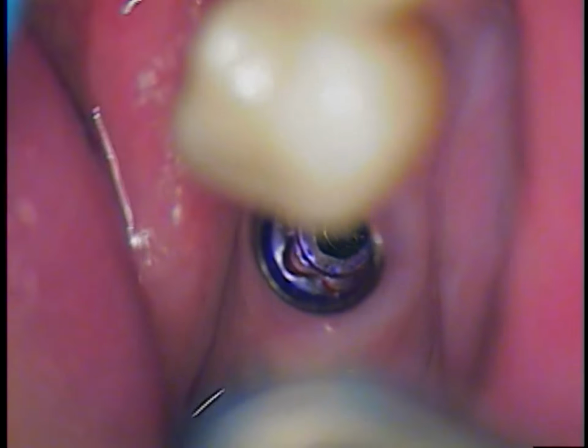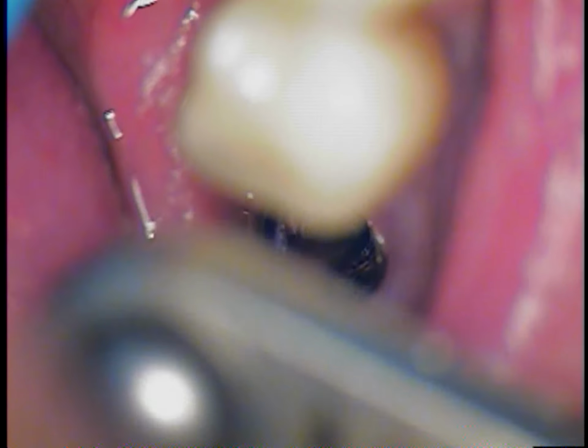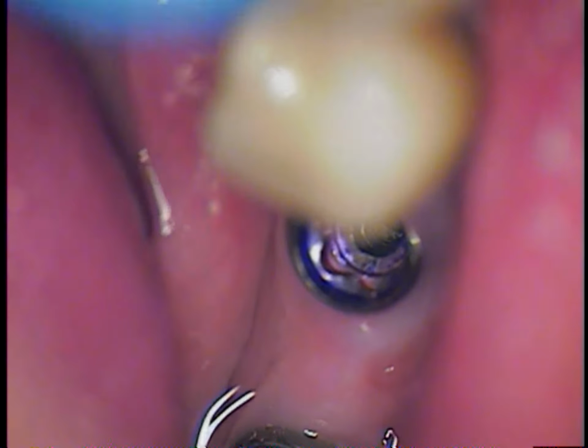a screw threader through the fixture. So that is coming. The use of the threader is coming. Just showing this initial footage here, just to show you that we are exhausting pretty much every principle that I initially wanted to attempt before we move on to more drastic measures.